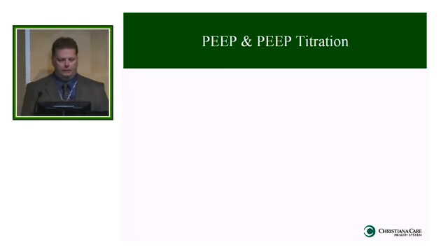So a little bit about PEEP and using PEEP to recruit the lungs. So there's a couple things you can do. You can just turn the PEEP up on patients, and that's sort of the basic way. That's what a lot of people do. A lot of people don't do it in a measured or a logical regressive way. A lot of studies use a very logical way because that's what you have to do when you study things. So a lot of these studies are going to be very rigid in how they use PEEP, and we probably should do more of that at the bedside. We probably should not just tweak the PEEP to make the SAT look better. I'll mention that when we talk about monitoring of lung recruitment, but that's what we do a lot: we see a bad SAT, we tweak the PEEP. You know, should we really just be doing that?